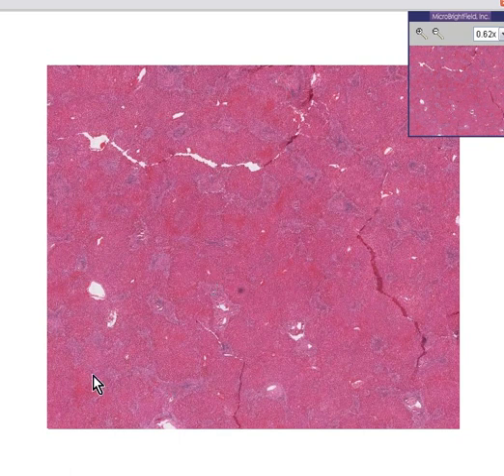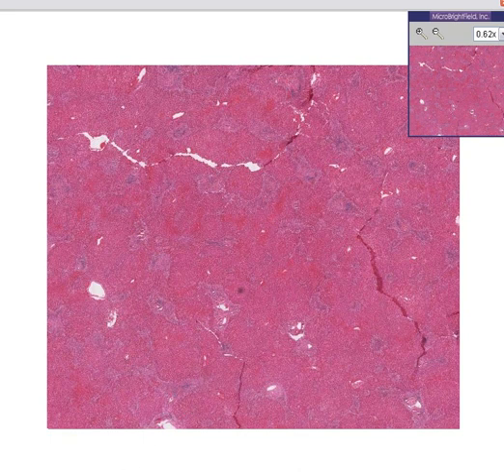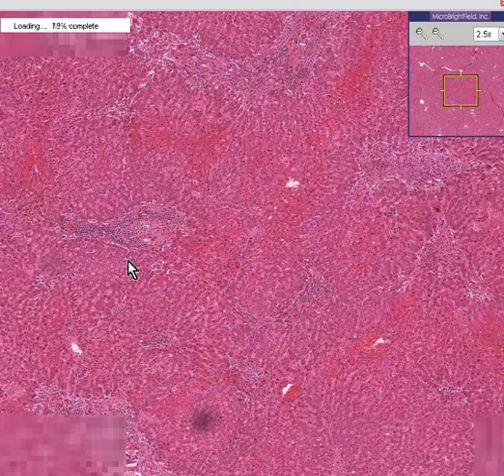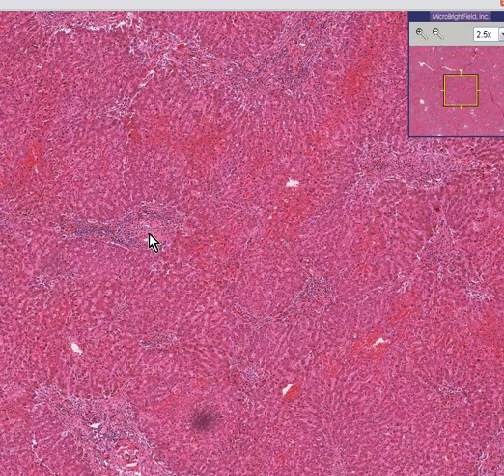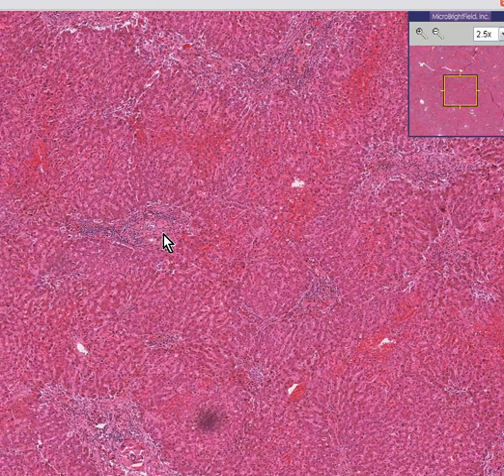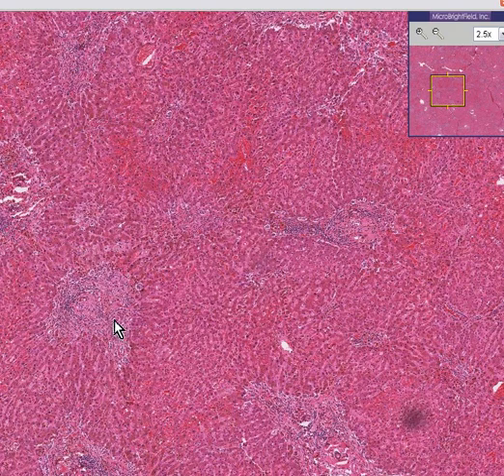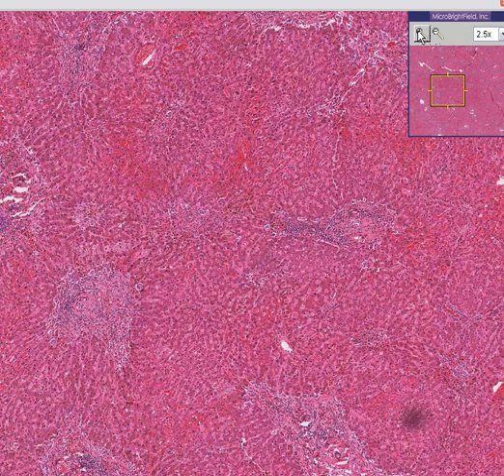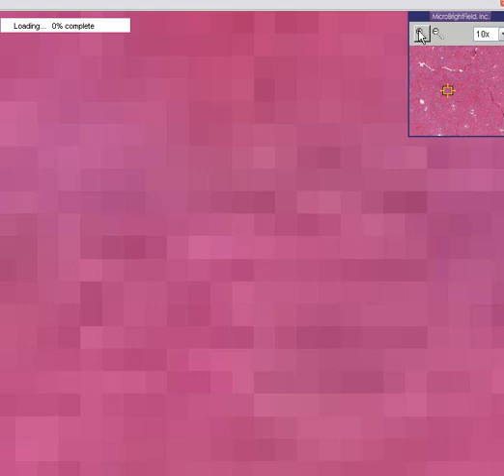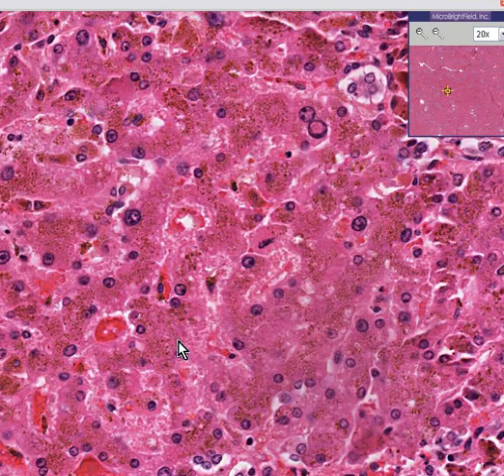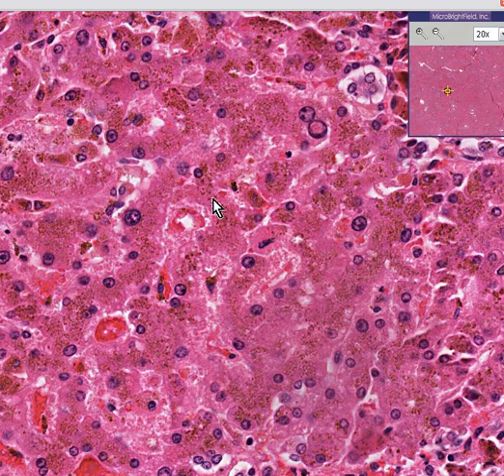This liver is actually darker and redder or browner than usual. The general portal-to-portal architecture looks kind of barely preserved. Here's a portal area, here's one, here's one. But notice there's a lot of fibrosis around this portal area, so we have some kind of damage. Also notice that when you zoom in, the hepatocytes themselves are darker than usual.